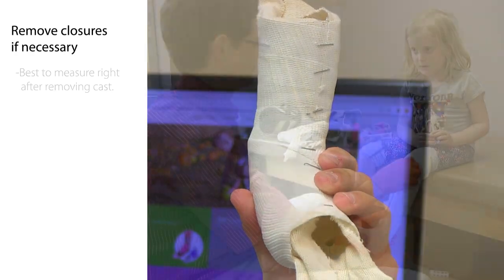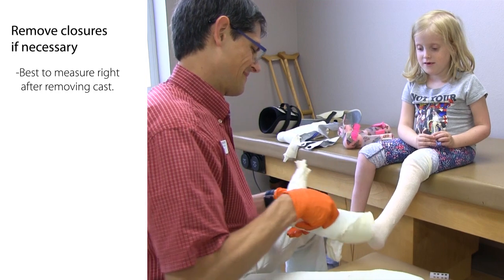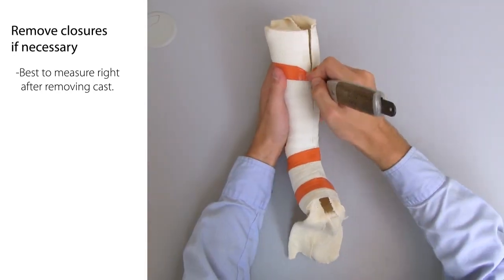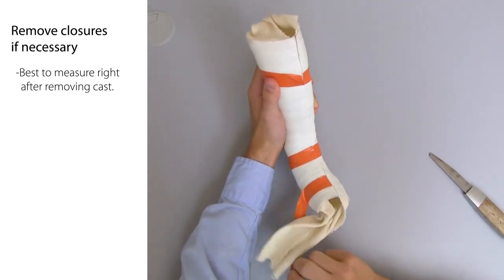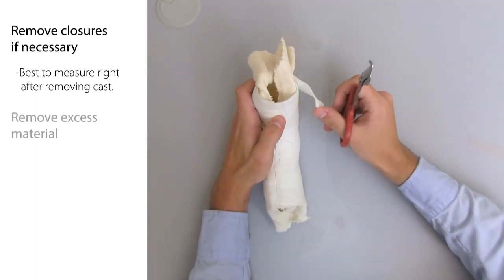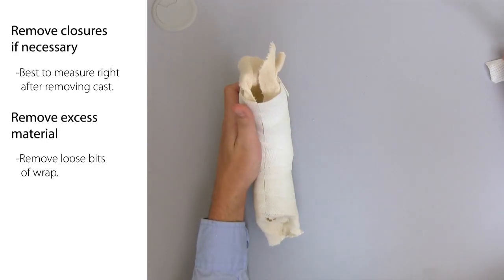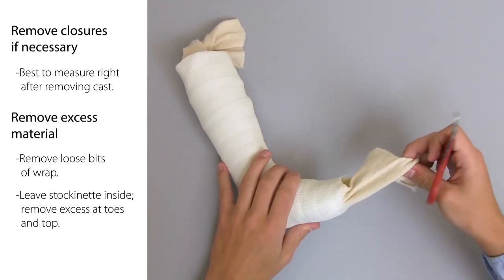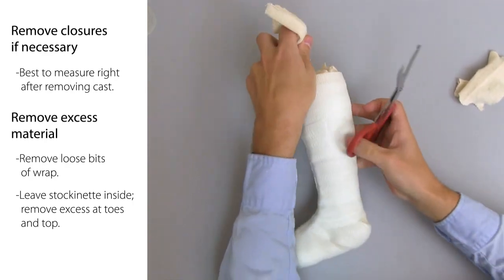Once you've created a good cast, here's how to get ready for measuring thickness. Remove closures if necessary — it's easiest to measure the cast thickness right after removing the cast from the patient because the casts are still a little pliable. But if you're measuring much later than that, remove any tape or staples that are closing the cut seam so that it's easier to get the calipers inside. Remove any loose bits of wrapped material so they don't interfere when measuring or scanning later. Leave the stockinette in the cast, but trim excess stockinette at the toes and top so it doesn't get in the way when measuring or scanning.